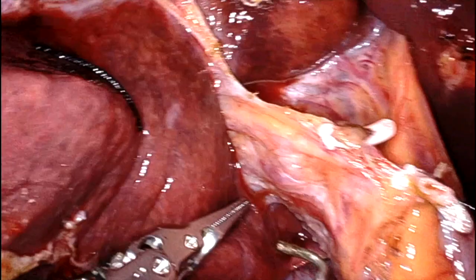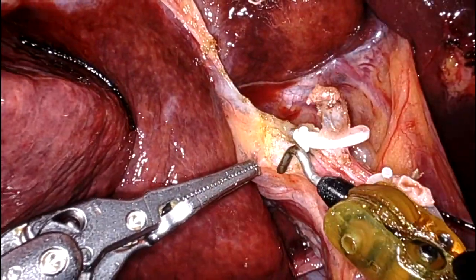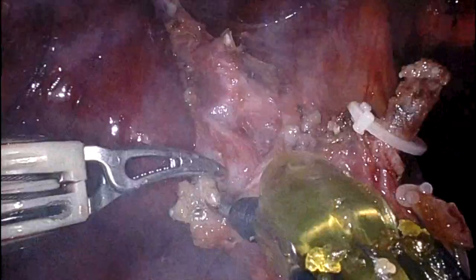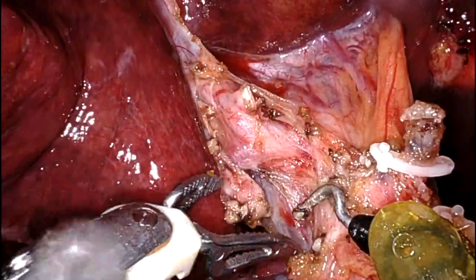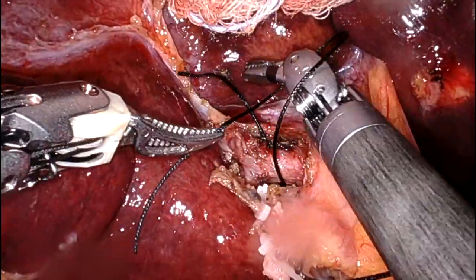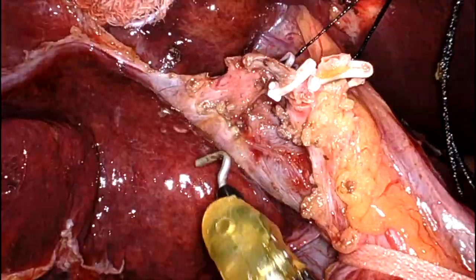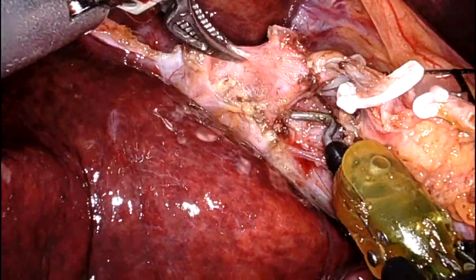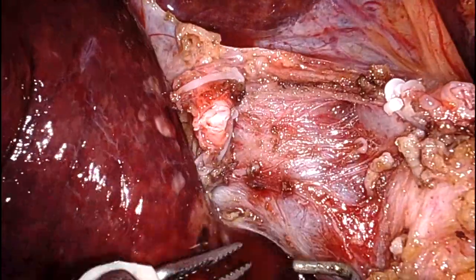Starting the hilar dissection — the assistant helps by pulling the cystic stump to the left. This is the right hepatic artery, and you can see the bifurcation and the stump of the cystic artery. I divided it close to the artery. This lymph node was in the way, so I took it out and sent it. I also tied the proximal artery so the assistant could pull on it for the portal vein dissection. I decided to dissect the anterior and posterior branches separately, clipped both of them, and divided the artery, which gave me a great view of the portal vein.